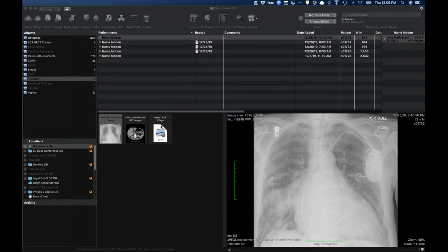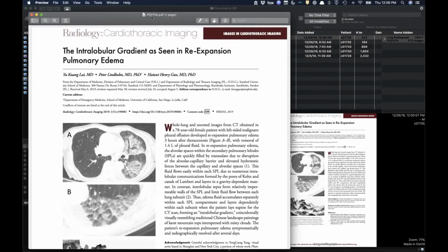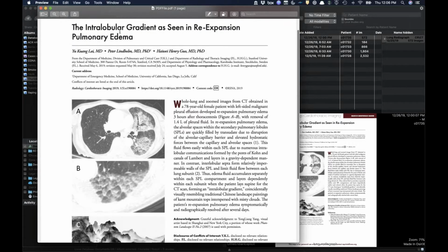So, Howard, I think you in particular hopefully will like this one. I just saw this morning, but it brought to mind this recent image in medicine in the new Radiology: Cardiothoracic Imaging. Did you guys see this? No. This particular thing? This is kind of cool.